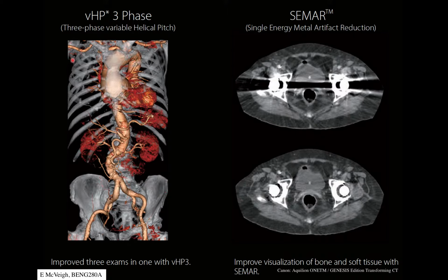So this is cut into slices. Each one of these axial slices is like 512 by 512. And then you can have many thousands of slices, like up to 2,000, 4,000 slices of data to go through, right? So it's a big data problem in its own right, even though when you look at it like this, it's just a picture. It's a single picture, right?